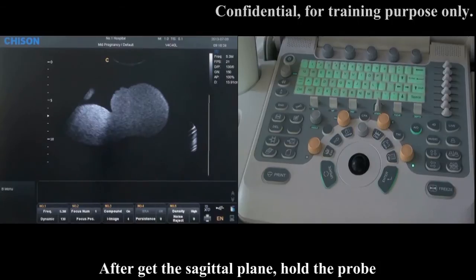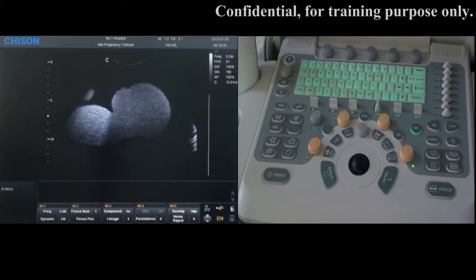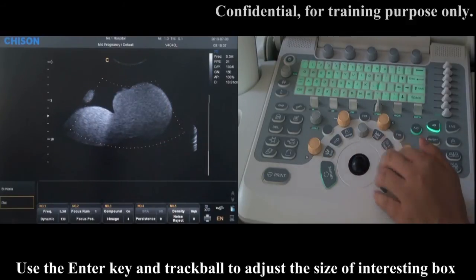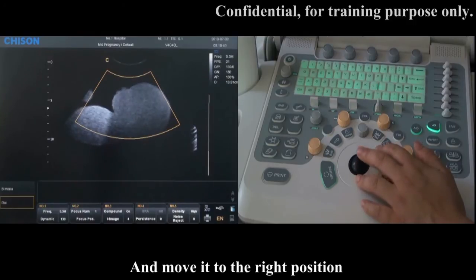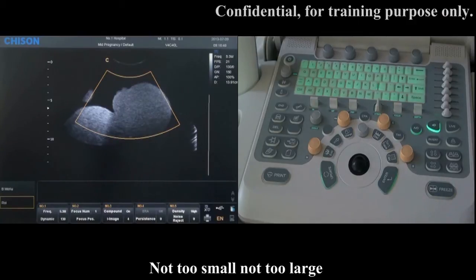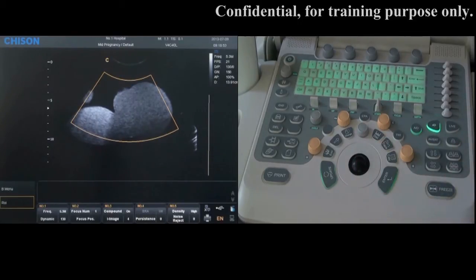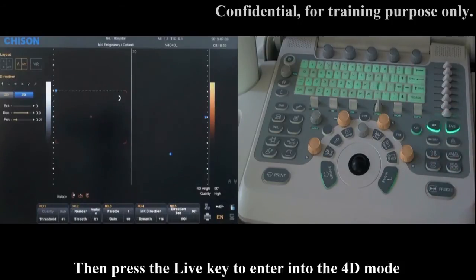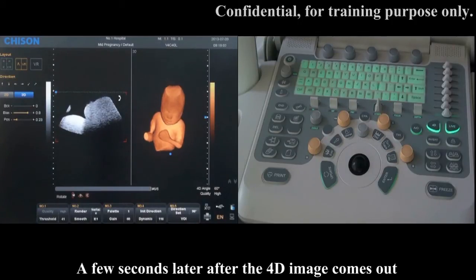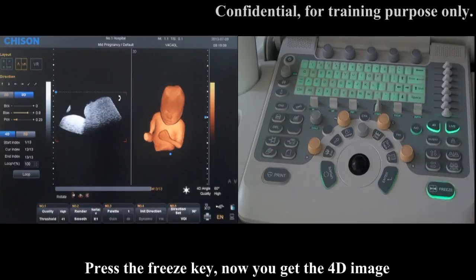After getting the Sagittal plane, hold the probe and press the 4D key. Use the Enter key and trackball to adjust the size of the region-of-interest box and move it to the right position. The size of the box should be appropriate — not too small, not too large. Move it to contain the whole fetal head. Then press the Live key to enter into 4D mode. A few seconds later, after the 4D image comes out, press the Freeze key. Now you have the 4D image.